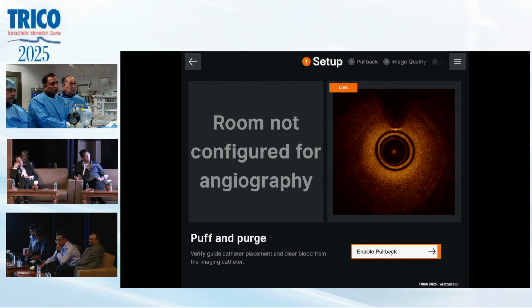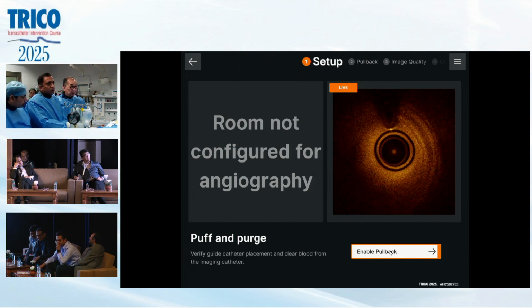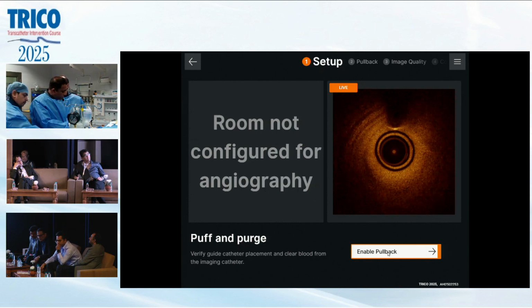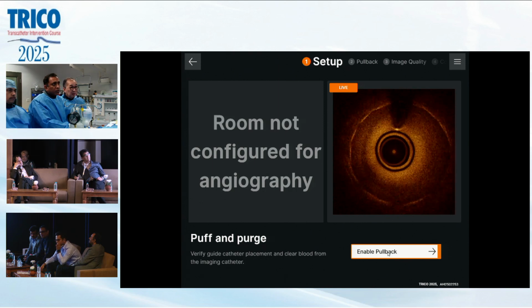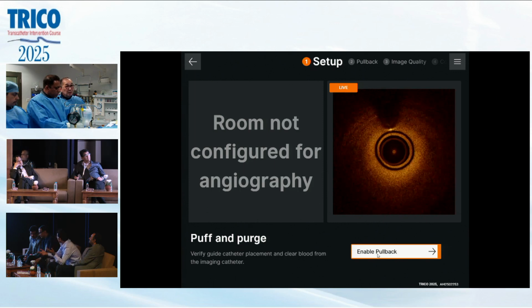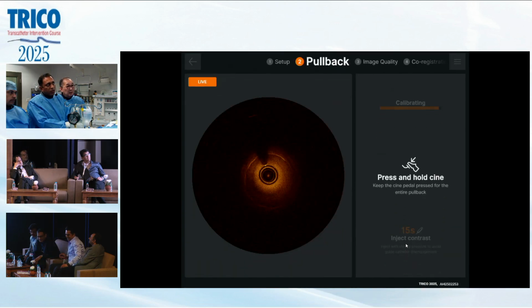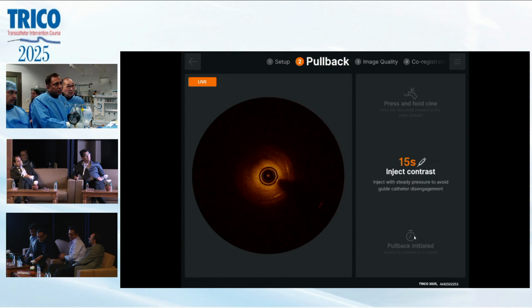Ready? Pull back. Still pull back. Okay. Still pull back. Okay. Ready? Calibrating. Tell me. Pressing.